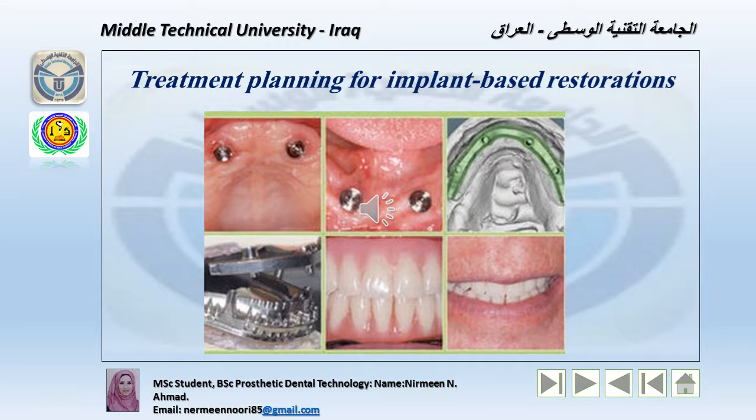After we know about the CAD-CAM system, I will explain to you a treatment planning for the implant-based restoration. The first phase of implant dentistry is planning. It is insufficient to identify an edentulous space or missing tooth and simply initiate surgery.